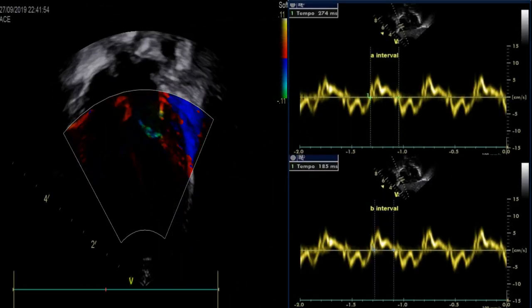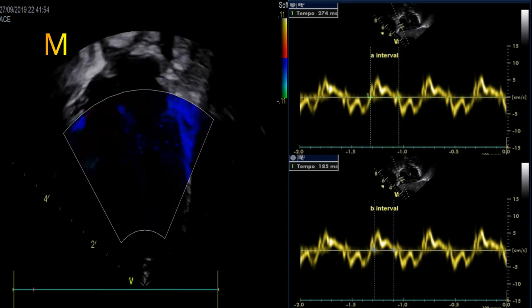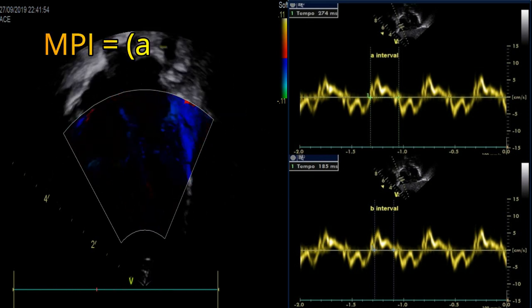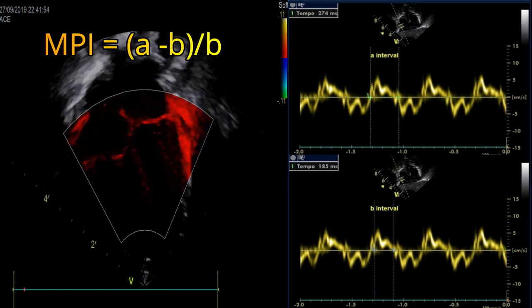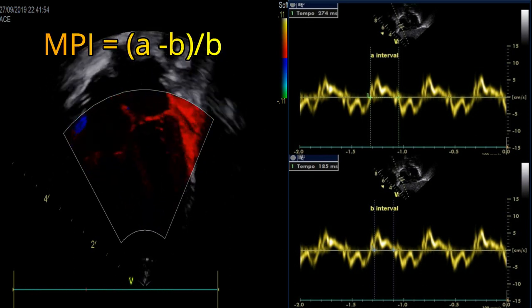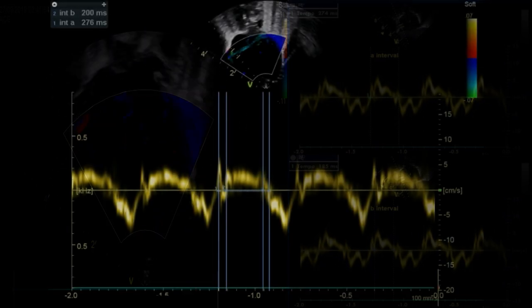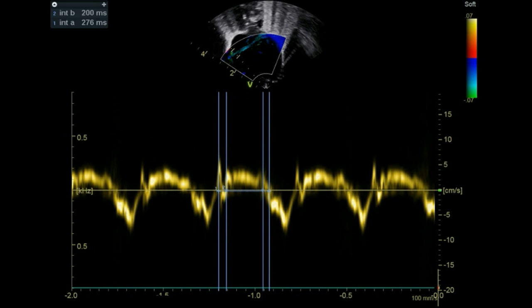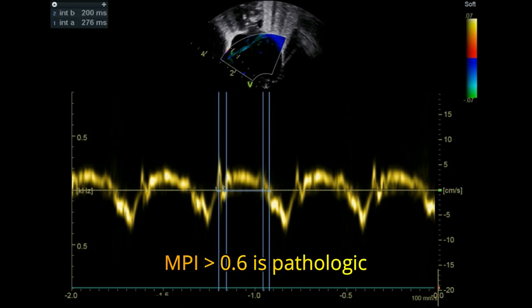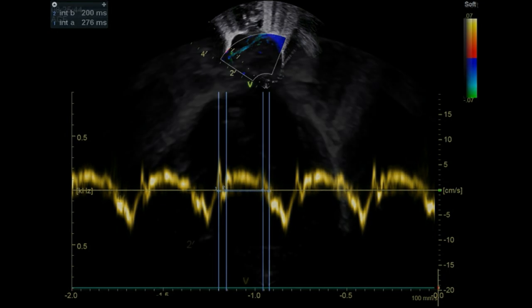The myocardial performance index represents the relation between the sum of isovolumic contraction and relaxation time and ejection time, and can be derived from pulsed Doppler or tissue Doppler. Right ventricular dysfunction, as well as increased right ventricular afterload, will increase the time of isovolumic phases and therefore lead to a higher myocardial performance index.